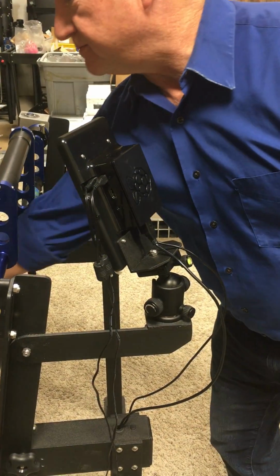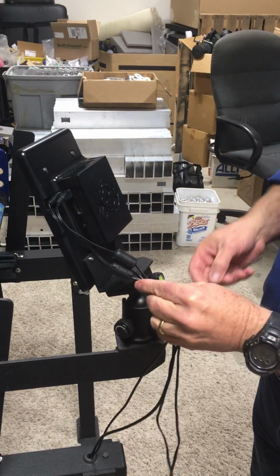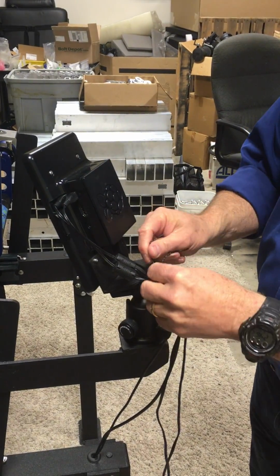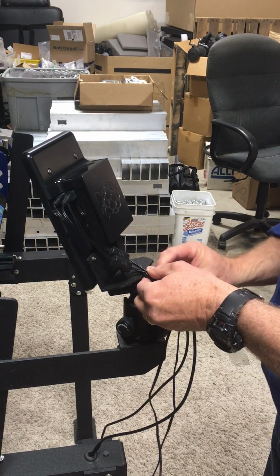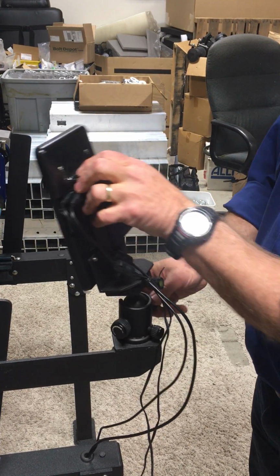Once you've done that, take this twist tie, gather these wires together, twist the twist tie around the wires, then attach them to this knob so that we have some strain relief. And there you have a replacement.